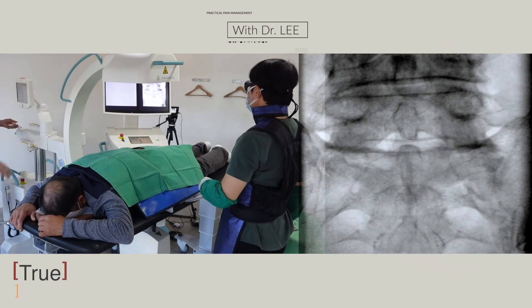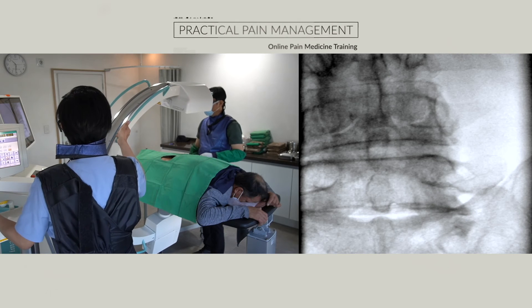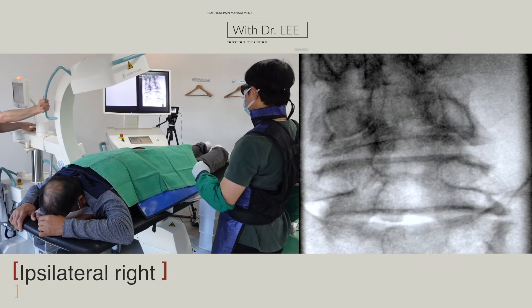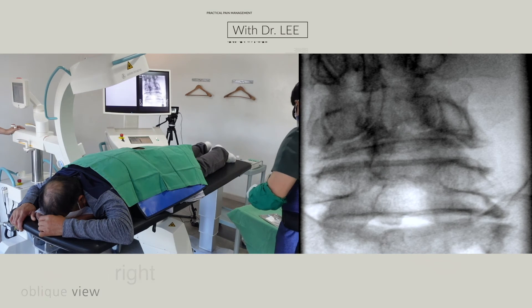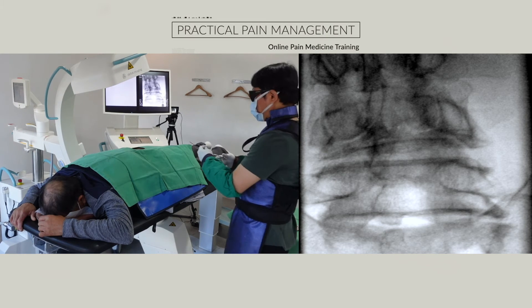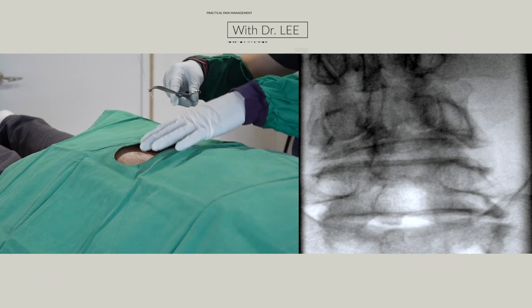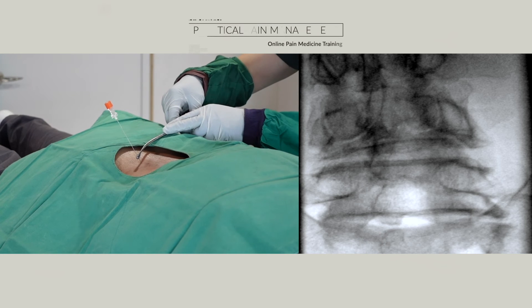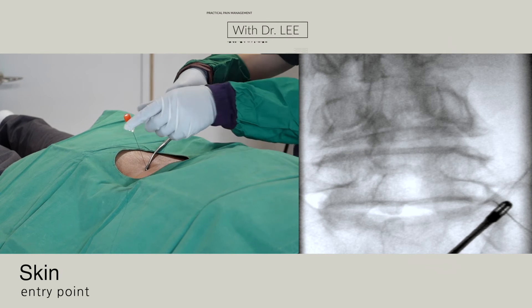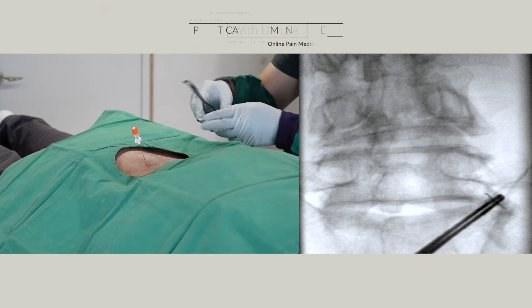True AP view. Cranial tilt AP view. Ipsilateral lateral right oblique view. Cranial tilt AP view.